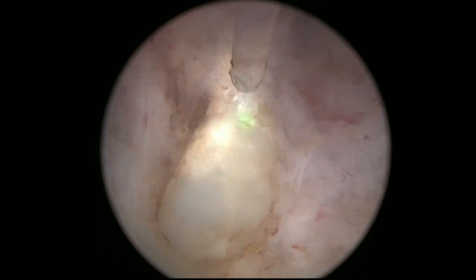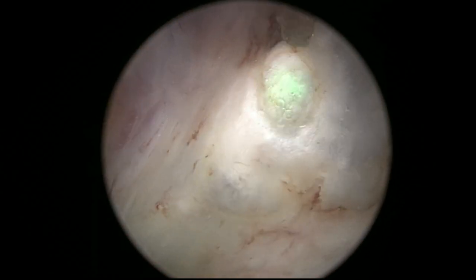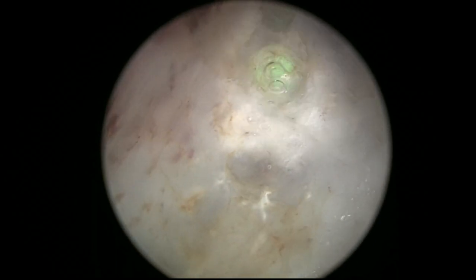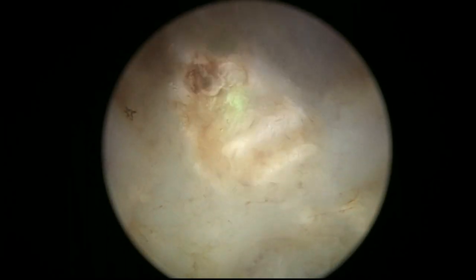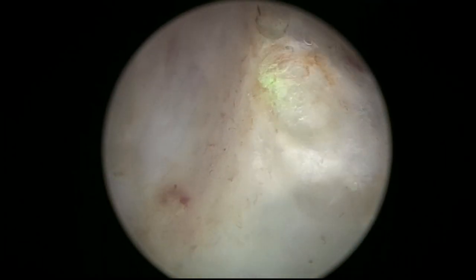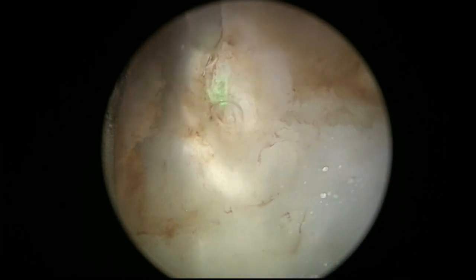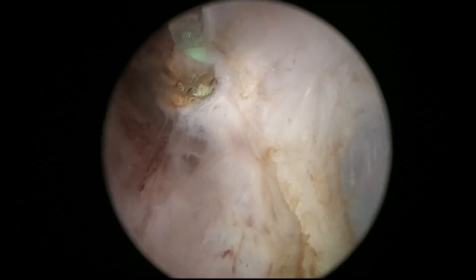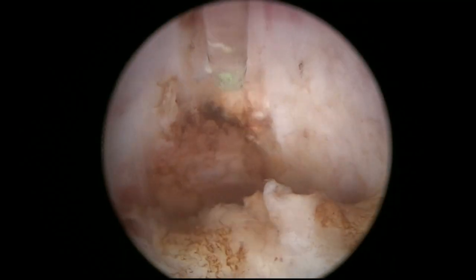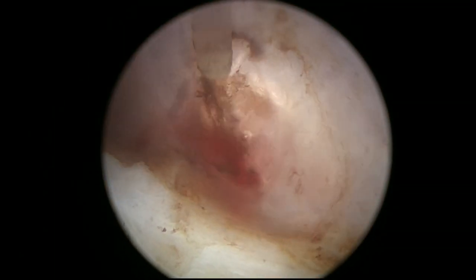I always try to look at the tissue characteristics to identify if I am at the interface between adenoma and capsule, getting inside the adenoma, or getting inside the capsule. I like to keep the cutting effect a little bit soft — I don't want to deepen too much with my cuts. I prefer to pass two, three, four times following the line with a smooth cutting effect, because this way, since I am moving, the energy is not working on the same spot for a long time. It is more difficult to penetrate the capsule deeply. I keep limits to my cutting and to the speed of my movement so that I cannot inadvertently cut deep into the capsule and produce a perforation.